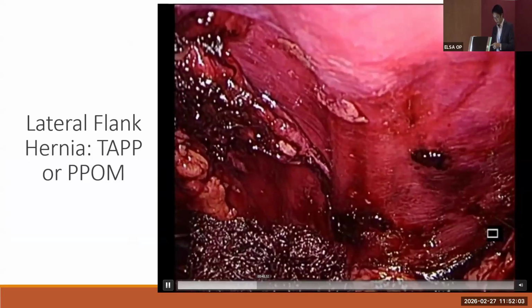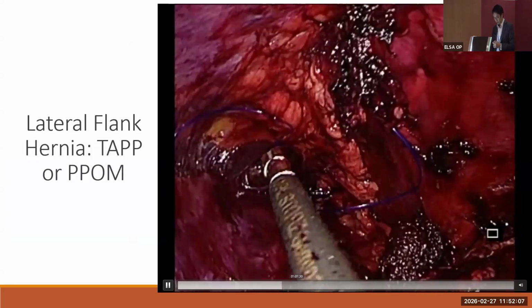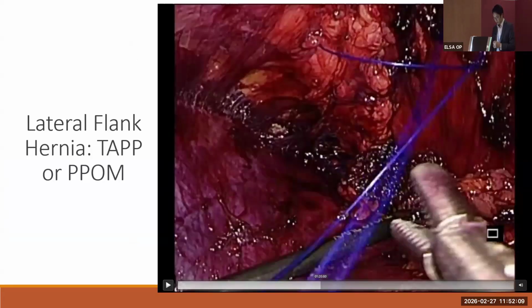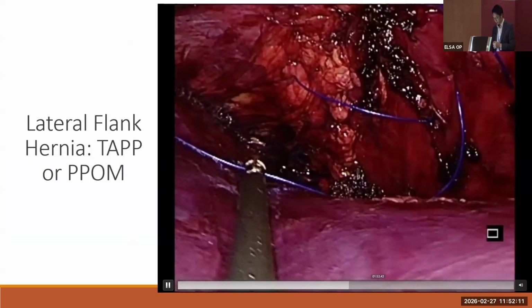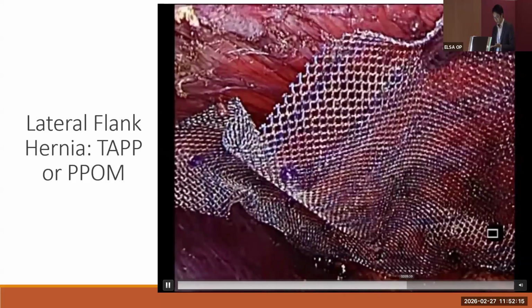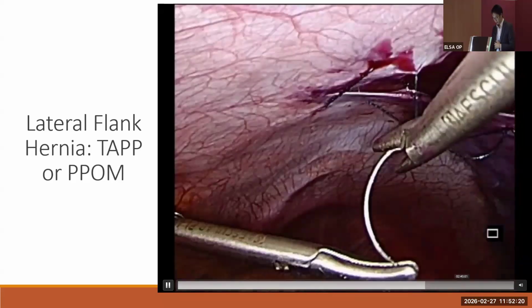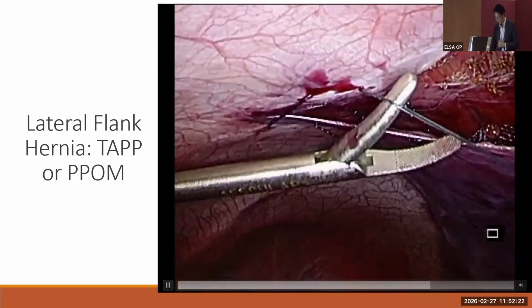Likewise, similar concept. You close it, either with suture passes or with V-Loc sutures, and then you put a simple plain uncoated mesh. It's just a very regular polypropylene mesh. And then of course you close the flap. On to the next slide.